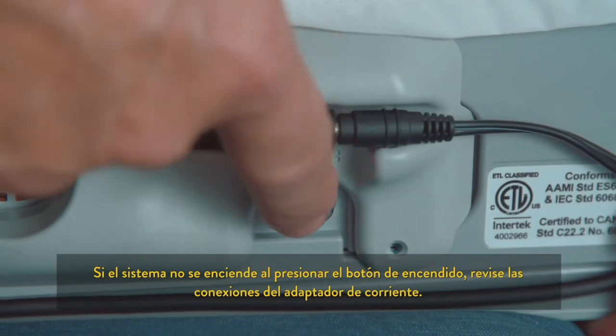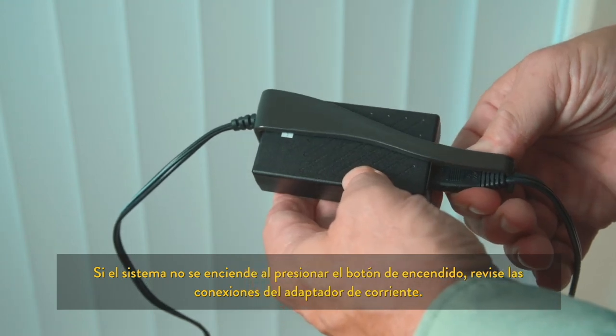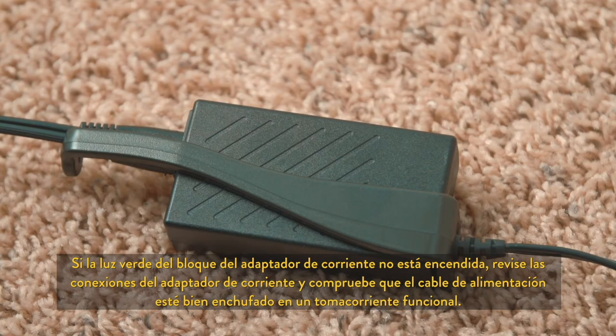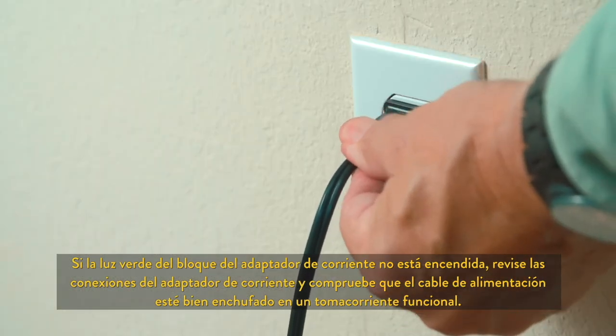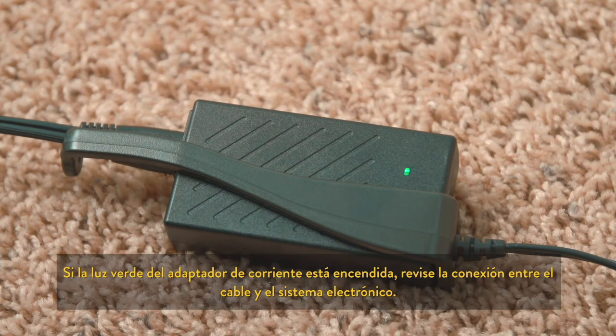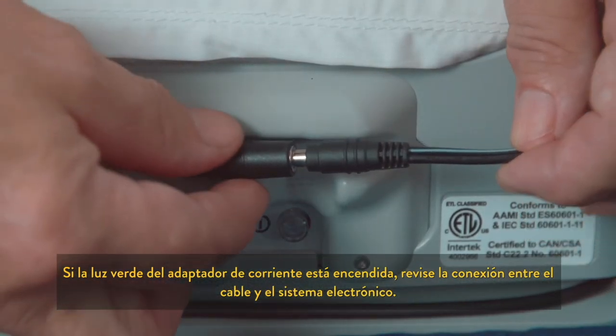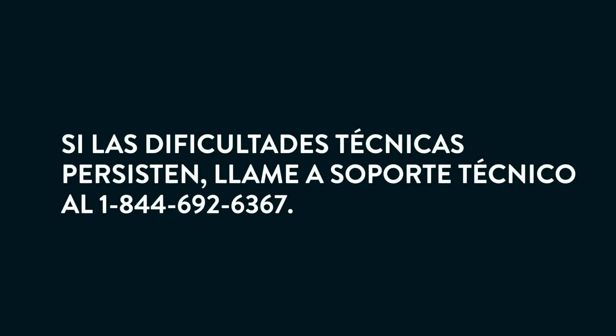If the system will not turn on when the power button is pressed, examine the connections to the power adapter. If the green light on the power adapter block is not on, check connections to the power adapter and confirm that the power cord is firmly plugged into a working wall outlet. If the green light on the power adapter is on, check the connection between the cord and the electronics system. If the system will still not turn on, please contact technical support at 1-844-692-6367.